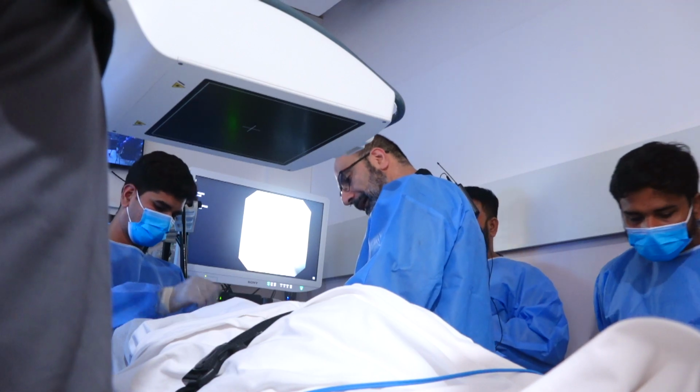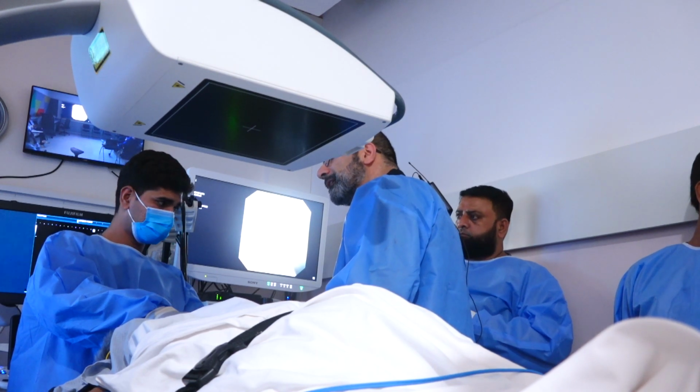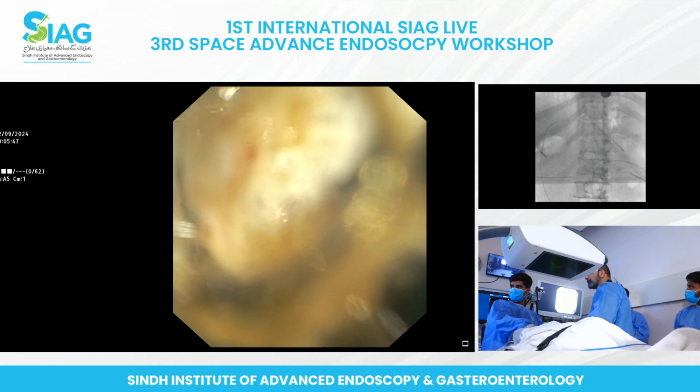So back tension. We're just advancing the stone extraction balloon into the stomach. Back tension. Hopefully we will see this all picture. Yeah, we can see it turning all the way. The stricture is right at the pyloric channel, which is right about here. It's where the clip is, a little above that. And that clip was there before. So now that's a Coley clip, I guess.